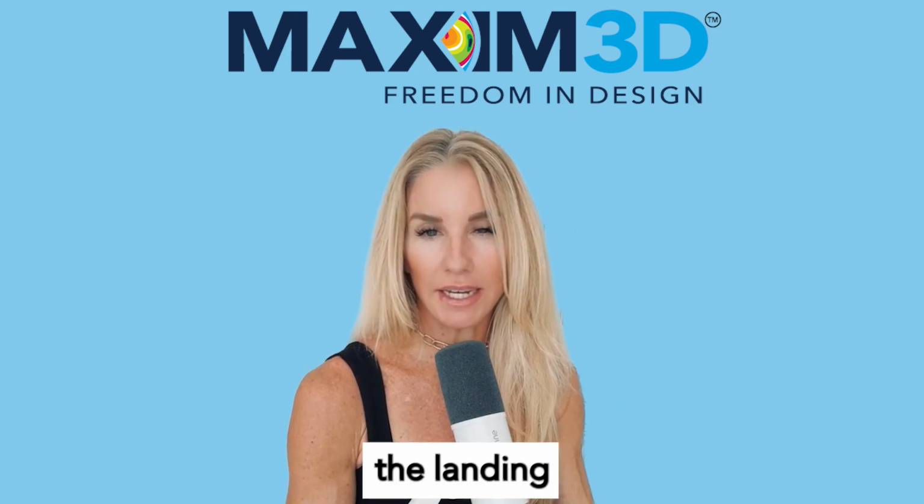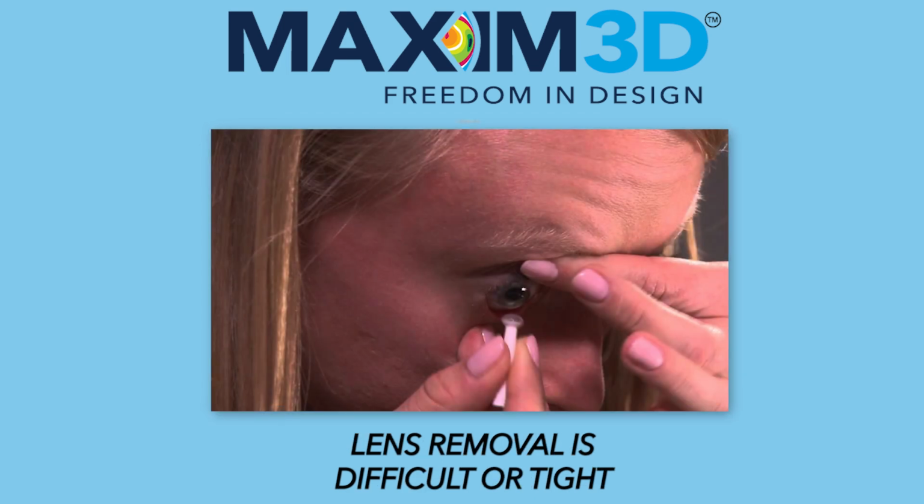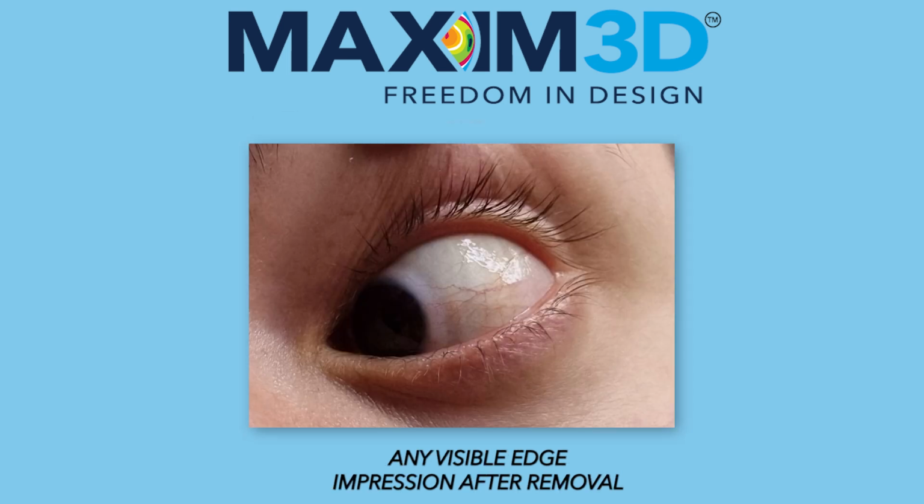Here are signs the landing is too steep. You may see vessel blanching under the lens edge, or lens removal is difficult or tight. There may be redness forming just outside the limbus and/or denting in the sclera. Any visible edge impression after removal is an indication of the PC4 needing further evaluation.